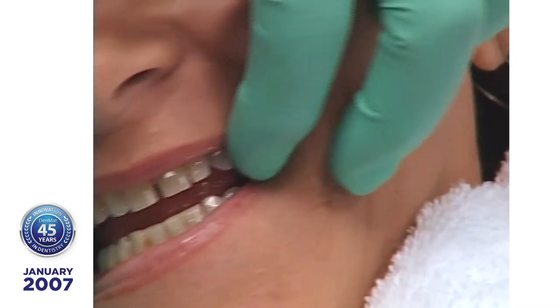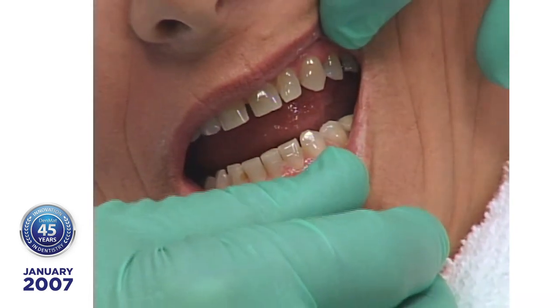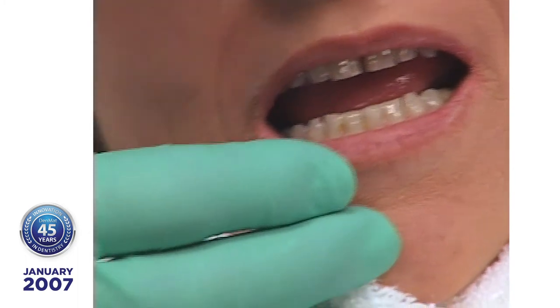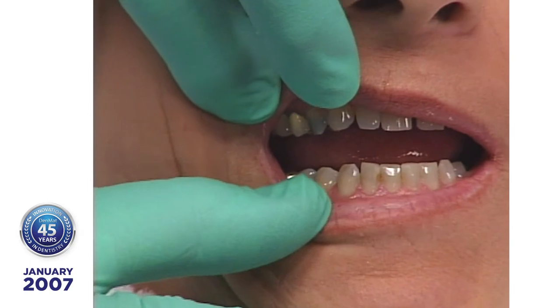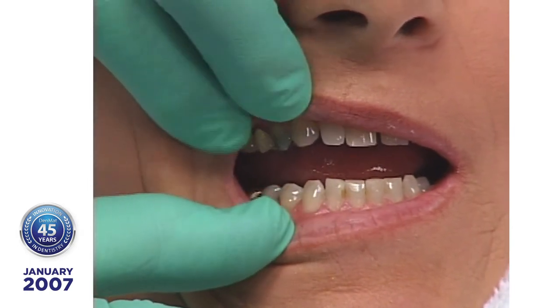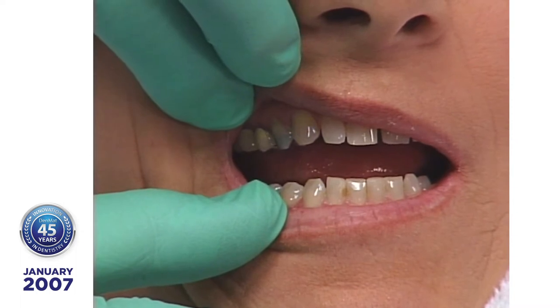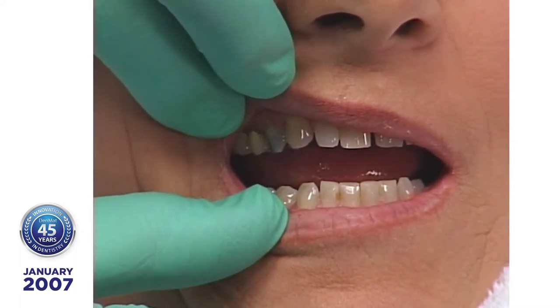We'll turn it sideways and put the cheek retractor in a little bit later. She has some tetracycline stain, and I'm not sure if we're going to use blockout or not. There's a porcelain crown on that second bicuspid. We'll probably use a little blockout on that first bicuspid with that amalgam — it's pretty gray, so for sure we'll put blockout on that.